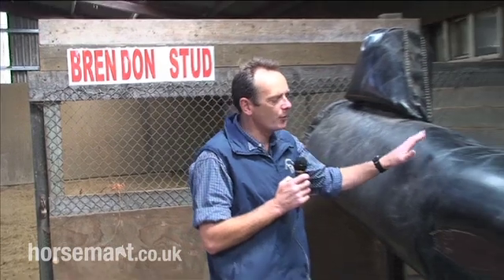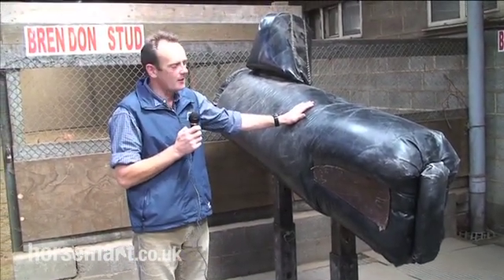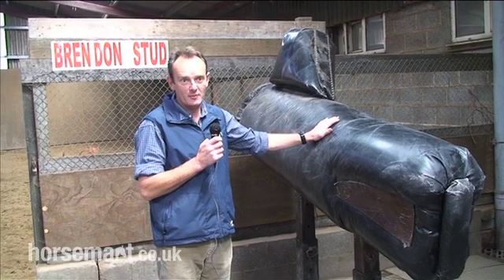We're here in the stallion collection area at Brendan's stud. The most important piece of equipment is our phantom mare, affectionately known at the stud as plastic PAM.